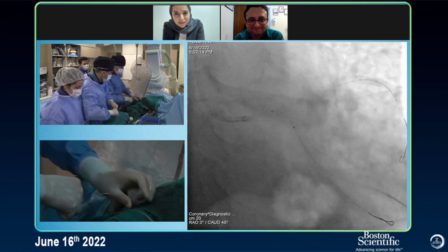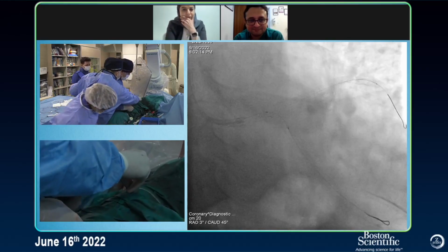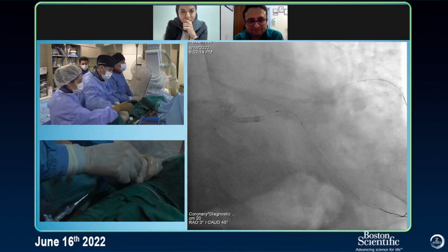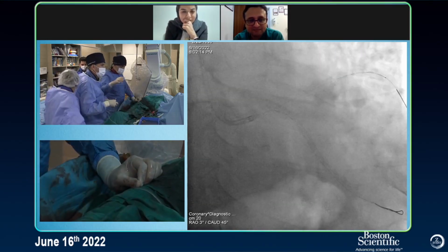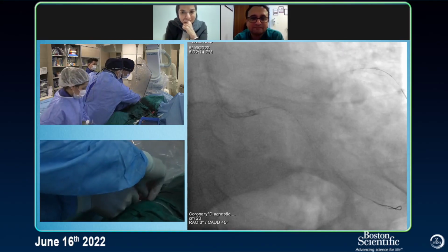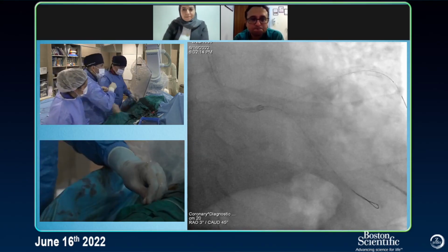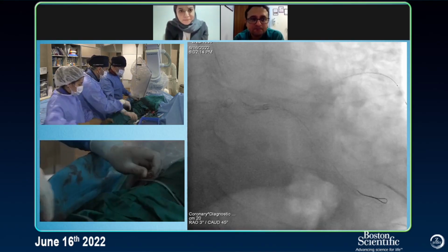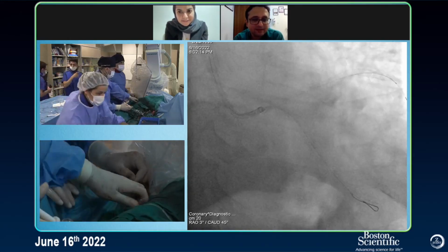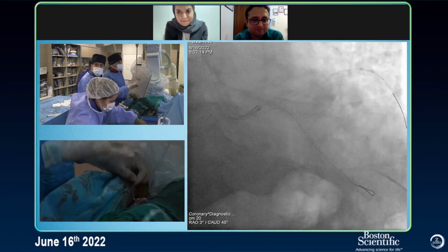So we'll see. Are you planning to do anything more, IVUS, in the meantime, or just final? Let's do IVUS, yeah. I don't think we can do much more than that, to be honest. I don't know if we go bigger balloons, but let's do IVUS, just to make sure, maybe there's one segment that we need to hit more. Sure, I agree. Before IVUS, do you want to see some spider view? What do you think? Because it will be the final for us. Spider.